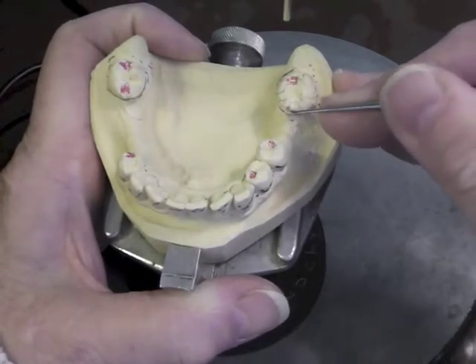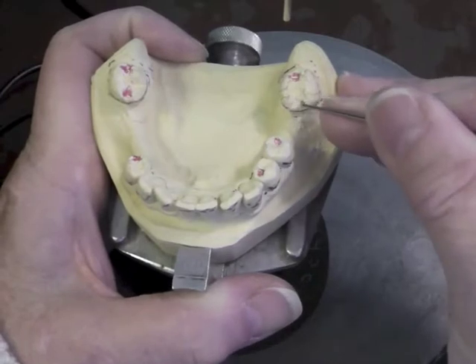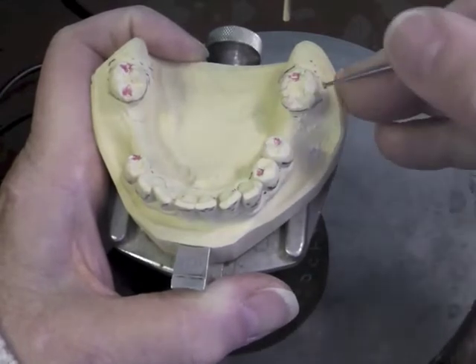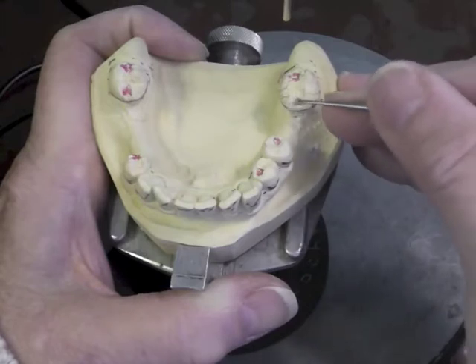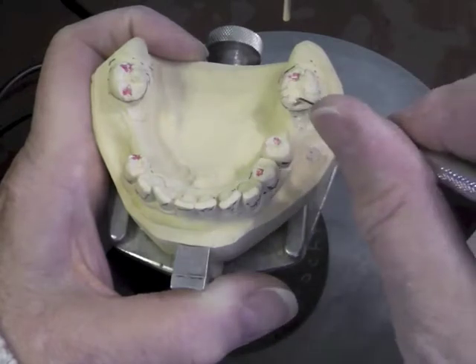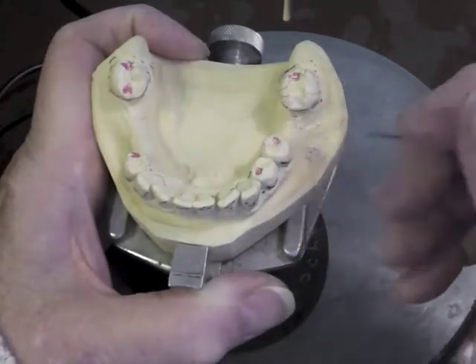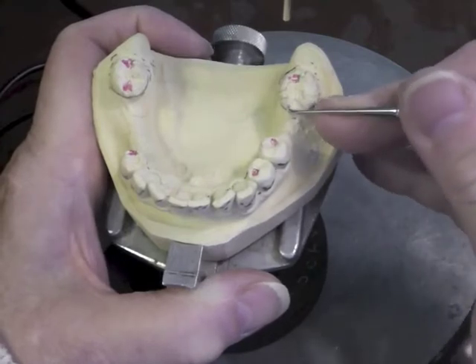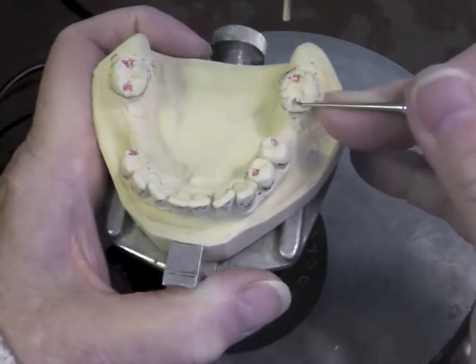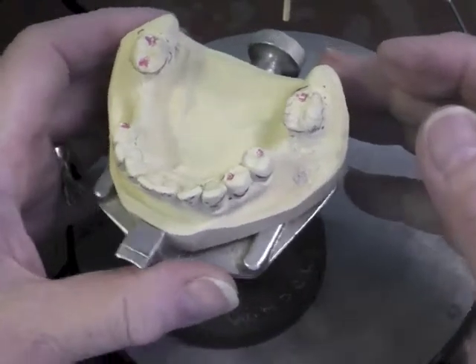I want to have a rounded occlusal rest — a spoon-shaped rest. Since my arm is going to go back in this direction, I need a little bit of a sluiceway in this area. My rest has to be deeper in this position so that it does not slide off the tooth. I don't want real sharp, deep, steep walls on that rest. I think I have that one in there.